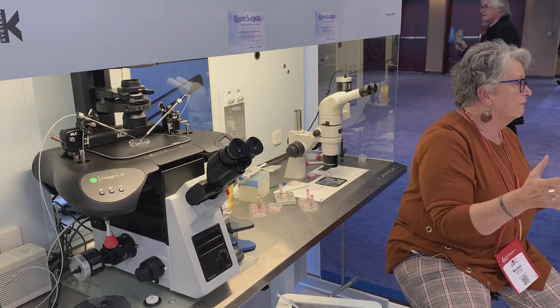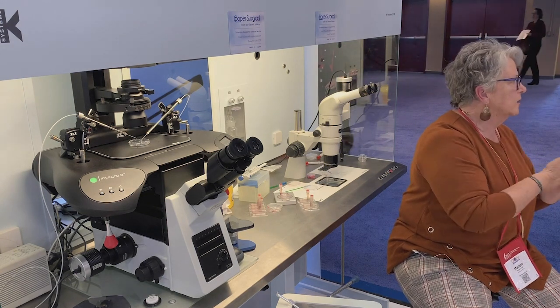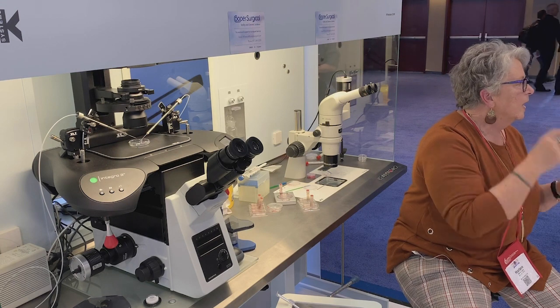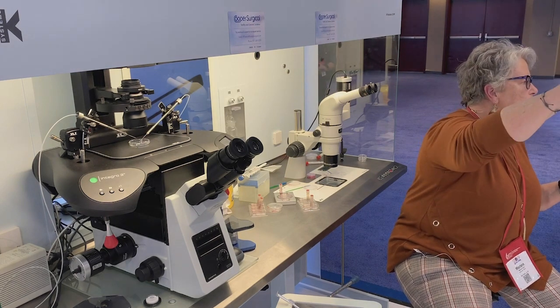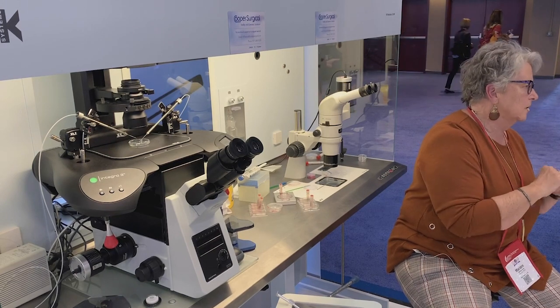With embryos, you can find them a little more easily, but with oocytes, if you've vitrified oocytes, they get transparent. You have a hard time finding them. So I'm fine with a drop that size for embryos. With an oocyte, I want it a little smaller.